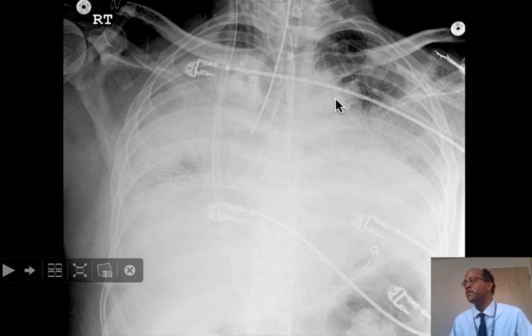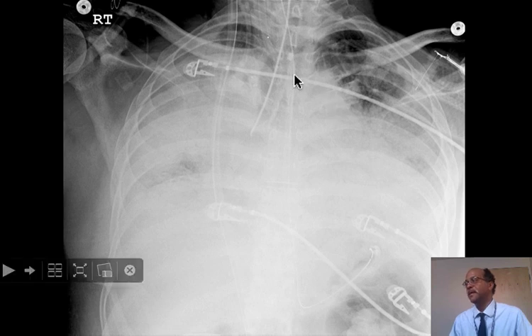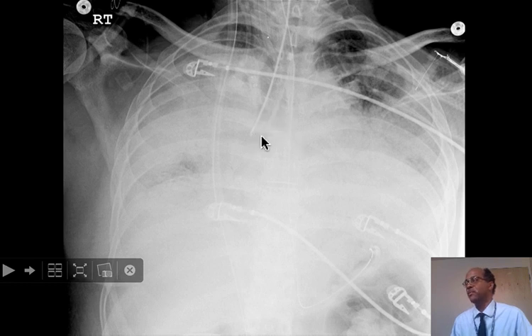Before we can know this, we really need to be able to assess where the carina is. The carina is where the trachea splits into the right and left main stem bronchi. Sometimes it's hard to see, but if we know where to look, we should generally be able to find it. First, we can identify the aortic knob — and the carina is usually just below that level and to the right. So we can suggest that this is the carina, and the tube is in the right main stem bronchus.